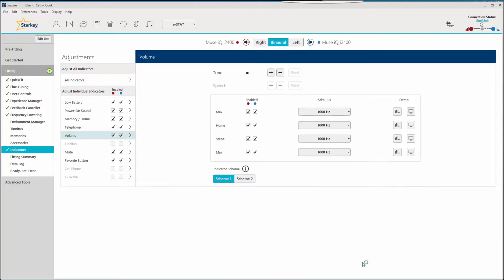Click on scheme one. It features one beep for minimum volume, three beeps for the home setting, five beeps for maximum volume, and one brief click for in-between steps.